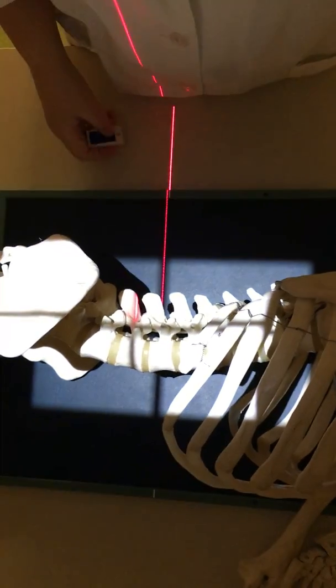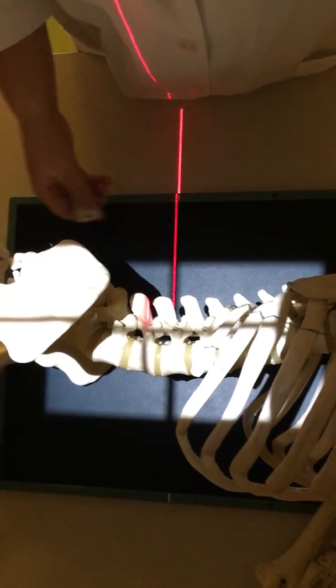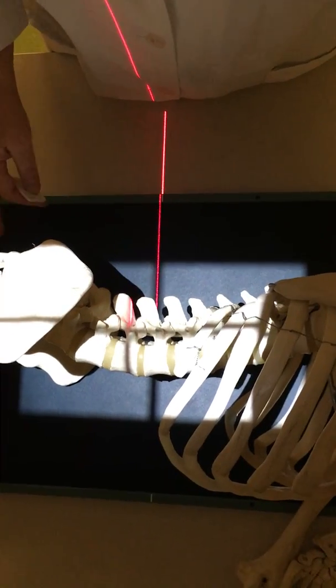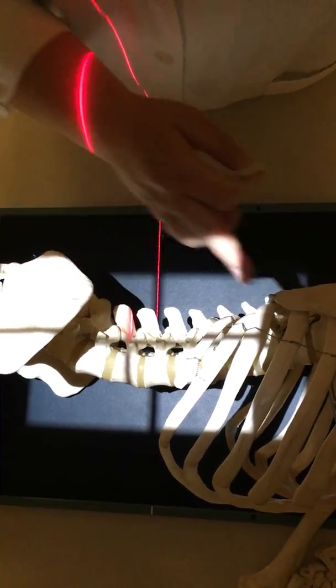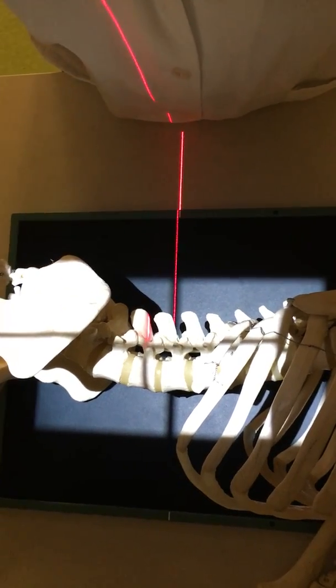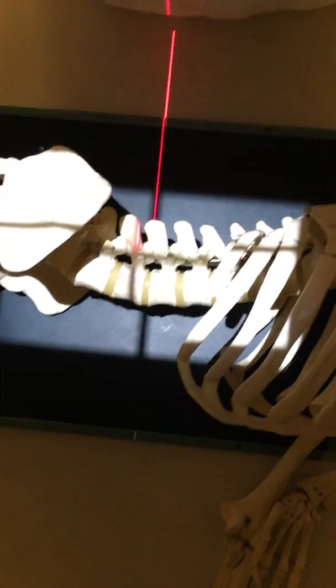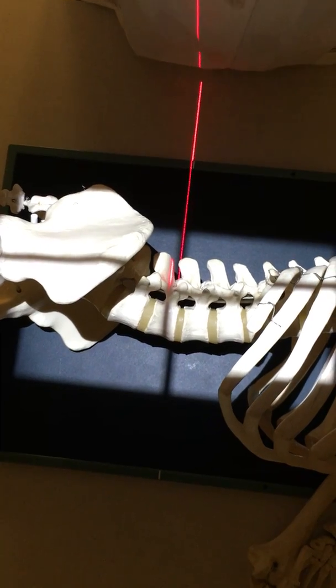When performing a lateral lumbar spine, again you will be using a 14x17 lengthwise or portrait, but your collimation will be 14 inches long by 8 inches wide, which is the exact same collimation that you use for your AP.